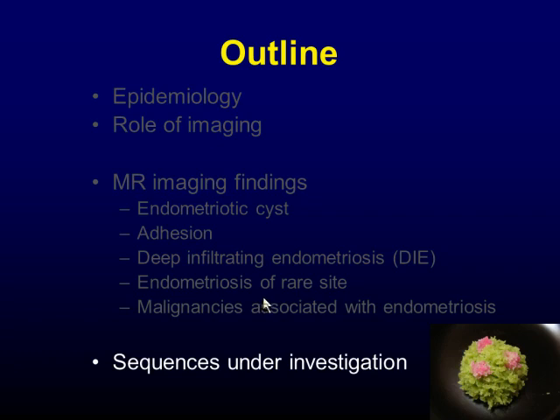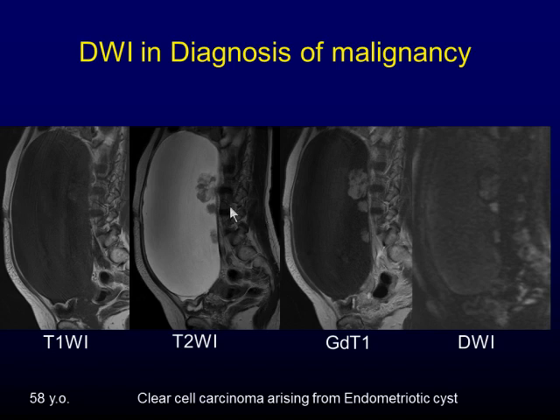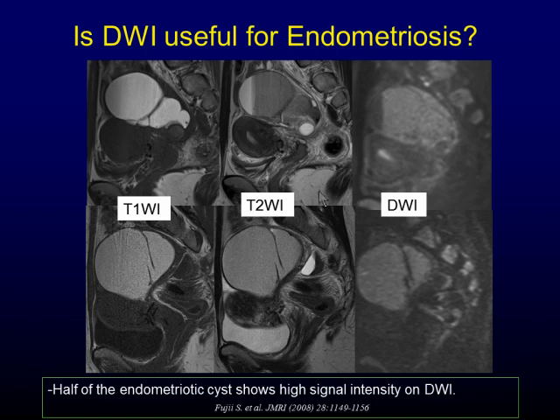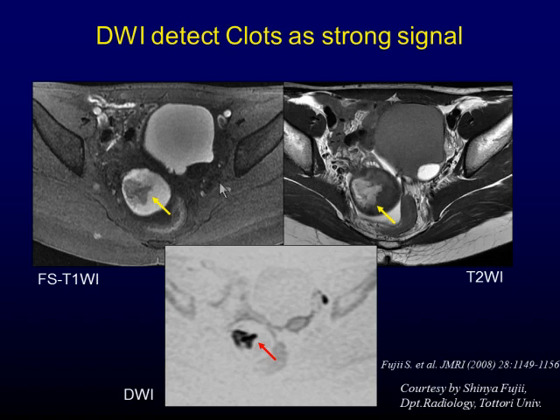Now let's move on to recent techniques. Diffusion-weighted imaging is now widely accepted in body regions and used for differentiating from malignancies. This case is a clear cell carcinoma arising from endometriosis. Mural nodules are enhanced and show high signal intensity on diffusion-weighted image, suggesting malignancy. Regarding endometriotic cysts, they can be diagnosed by conventional sequences. On diffusion-weighted image, half of endometriotic cysts show high signal intensity, making it difficult to say that DWI provides additional information. One important note is that a clot in endometriotic cysts sometimes shows strong signal intensity on diffusion-weighted image, and this should not be mistaken for a malignant region.